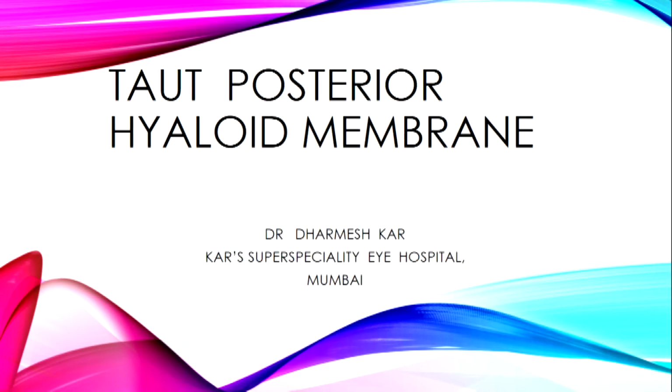Yeah, but I think the main thing I want to say here is that it probably will not close. It was a primary surgery. In the primary surgery, you were doing the retinal surgery. Okay. Since the hole size was more than 1,100 micron, the simple ILM peel probably would not have helped. You routinely do this for a large hole? Because I missed the initial part of your presentation.